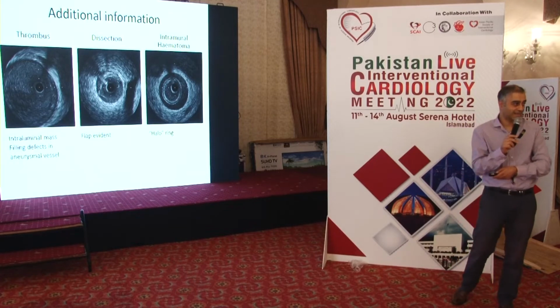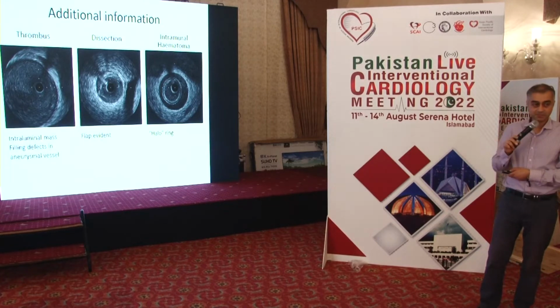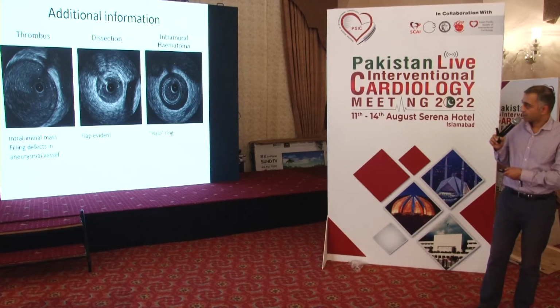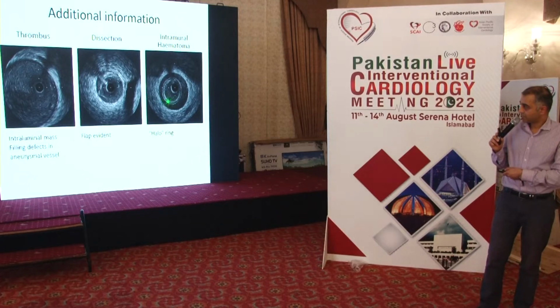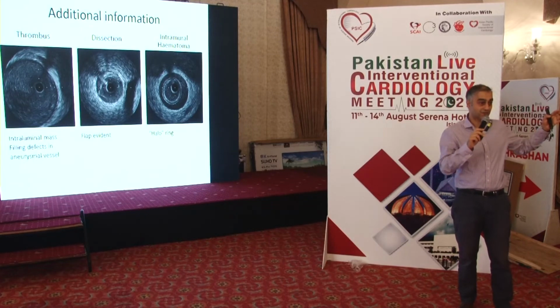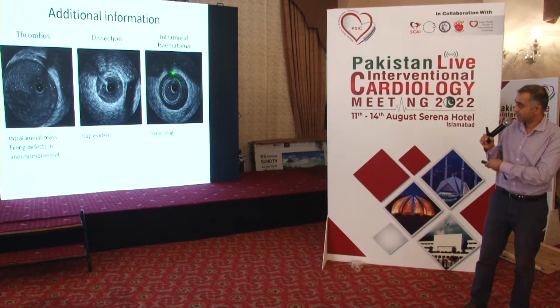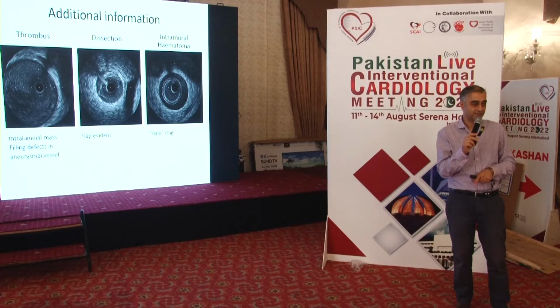So you remember the SCAD talk I gave yesterday, and this is the IVUS picture of a lady who had actually a left mainstem SCAD. So if you identify the media here, remember the media is black. Can you see here? This is the media. So whatever this process is, it's occurring outside of the media. So it's separating the adventitia and media. So this is a tear going all the way around, circumferential tear down the vessel. So this is a SCAD case. Very rare to see this.